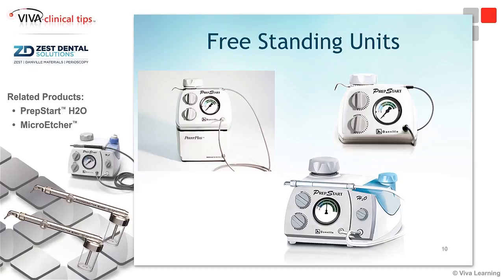The controls on this are a little bit different compared to the chair-side hookups. You can go onto the websites and take a look at these components, but you've got the ability to control flow and pressure with those dials, which is very, very nice. The unit on the left has what we would call the PrepStart, but it has a power plus pack. So if your office doesn't have the ability to get the energy needed to do satisfactory abrasion, you can simply buy a power pack unit that will increase the PSI directed through the unit — really a nice feature.